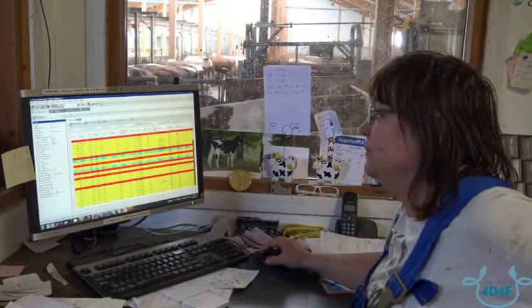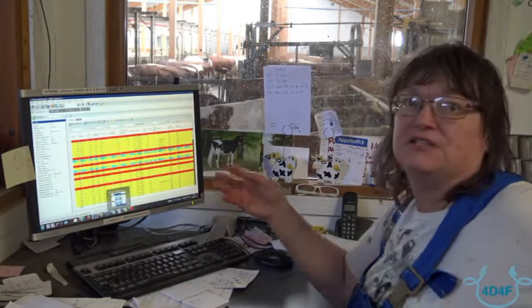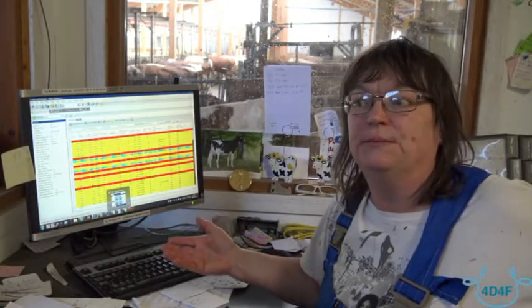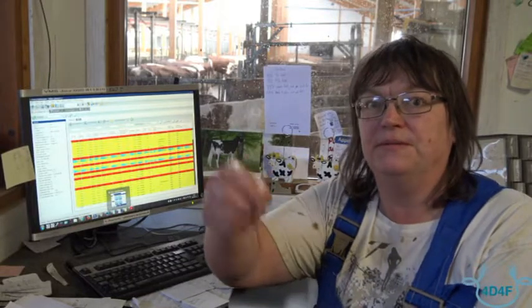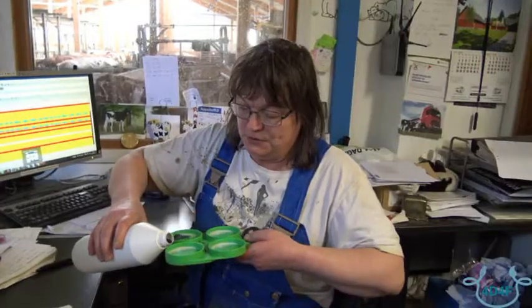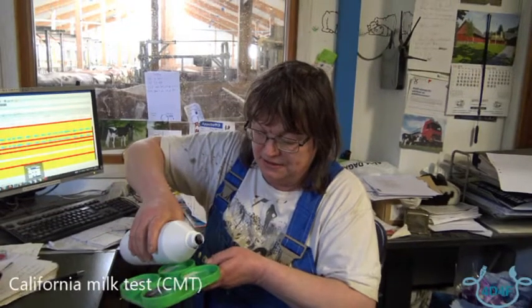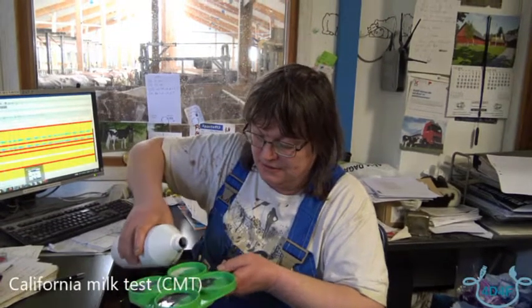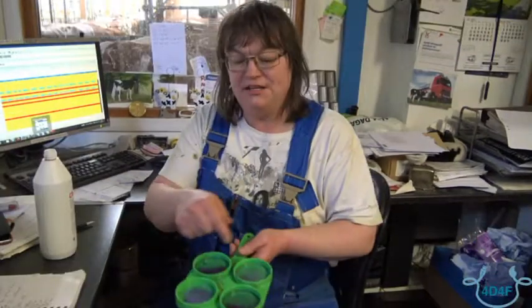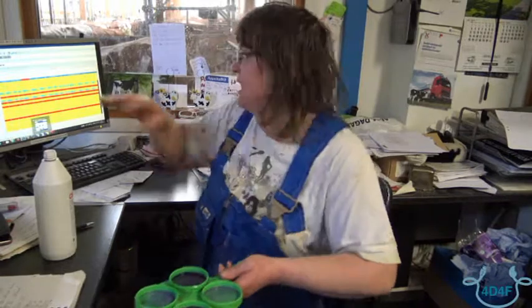When I see a cow has difficulties in her udder, I take a sample from each milking teat. You put some in each, and then you do like this. Then you can see if this is the same information as you have in the computer.